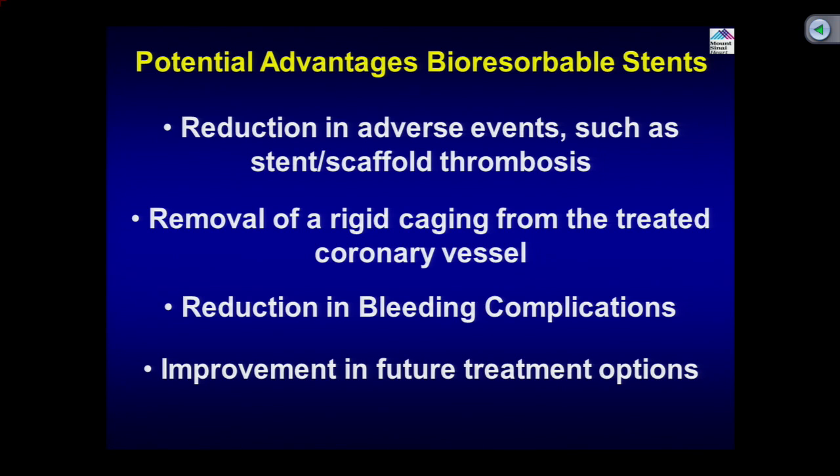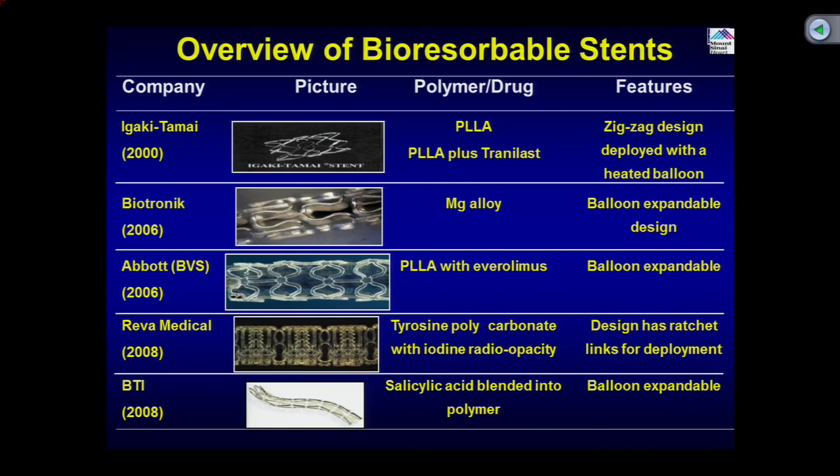After a few years, a metal stent encases the vessel, which cannot dilate or constrict, but once the stent is resorbed and its work is done, the vessel will behave normally. A person doing exercise will dilate 3 or 4 times what normal vessels do, and that actually has been shown. This is one of the very important aspects of the bioabsorbable stent, or scaffold, the term we use. Also, we expect that the delayed events will disappear.